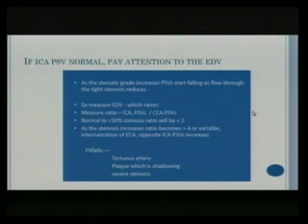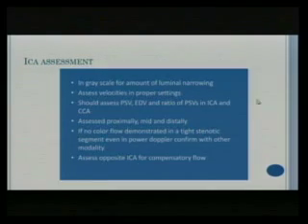Yes. A tortuous artery can, of course, because you're sampling at the site of tortuosity, there is inherent or innate turbulence at that site. That could be one pitfall. And of course, there's a lot of calcified plaque and you're not sure where you are sampling. That is another pitfall. And when there is marked or severe stenosis, you are not sure where to put your sample gate. That is another area which could be a pitfall.